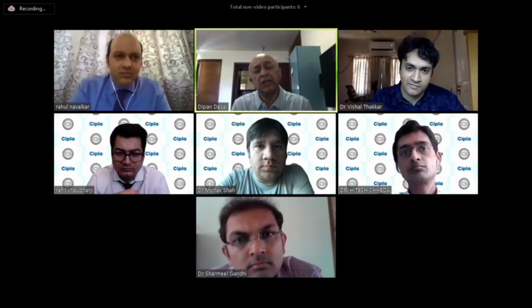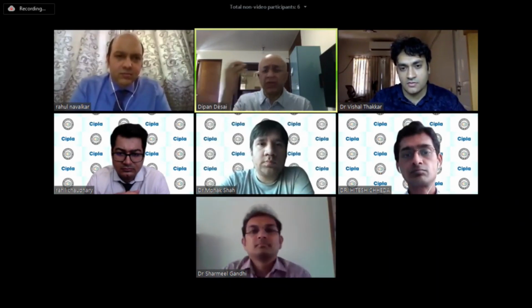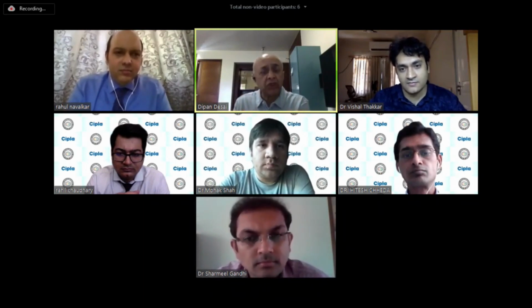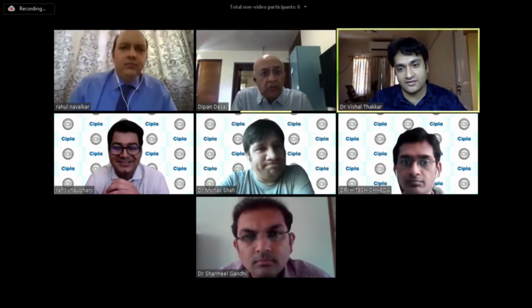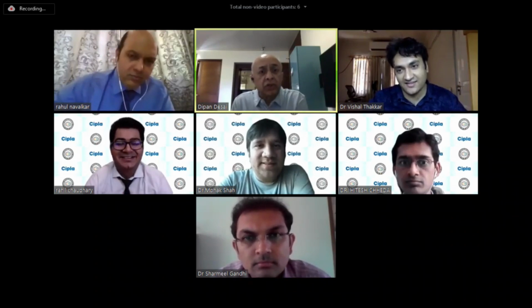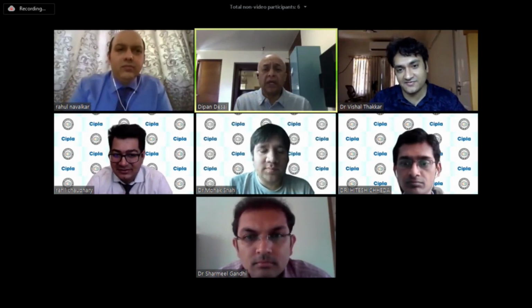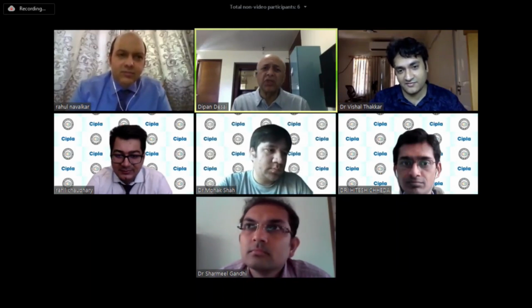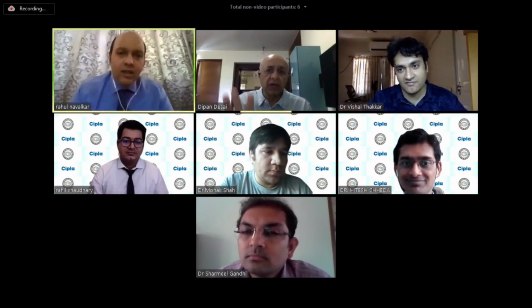But as far as the question you asked, Dr. Saab, Vishal, is that using the Aura, intraoperative aberrometry. Very simple, first of all, they're so expensive. Two, the important thing is that if you have that machine with you, you require a library of lenses. Whether you have multifocal lenses or toric lenses, you require a library. So it is very difficult for private practitioners and people in our country to use those systems. They are very good for AIIMS, for research purposes. As of today, this is my personal opinion.